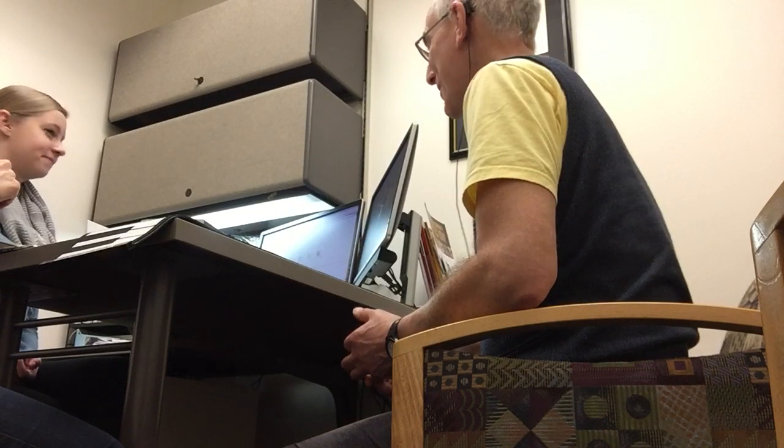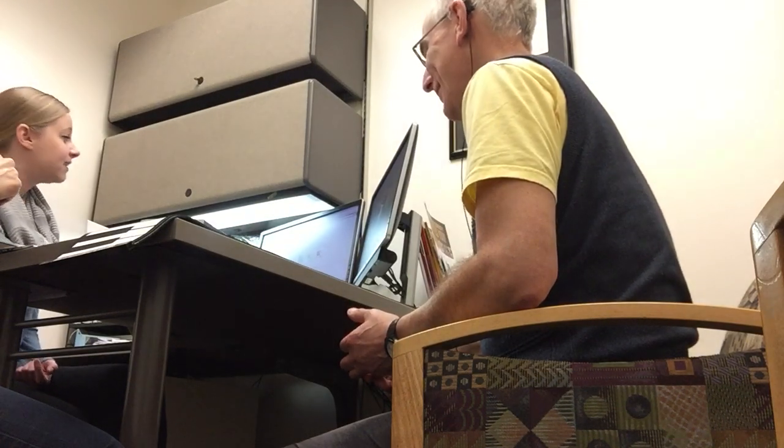Oh, that's pretty cool. Yeah. Told you I had a piano with me. You are correct. It's loading the settings, and once it's ready, we'll put the battery on it so you can hear again with it.